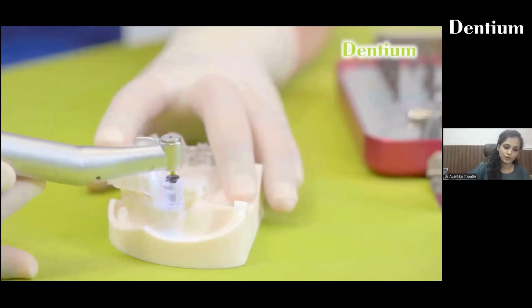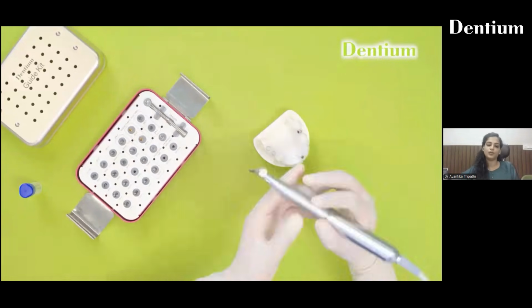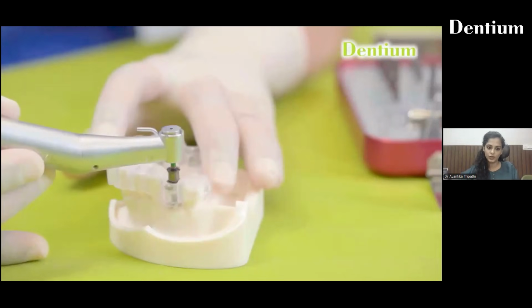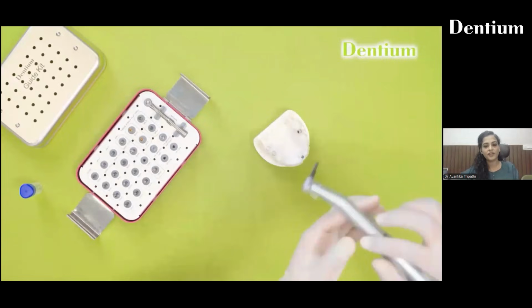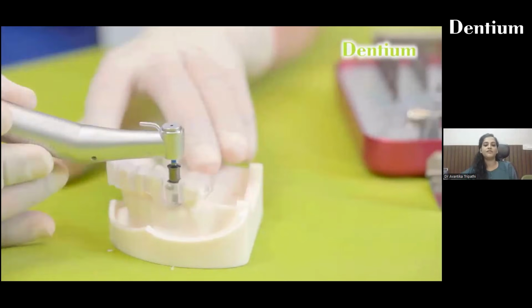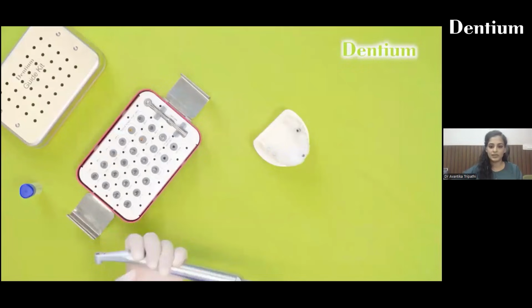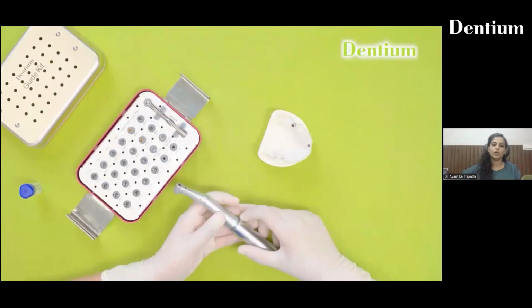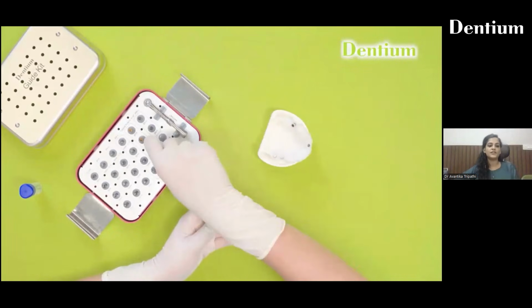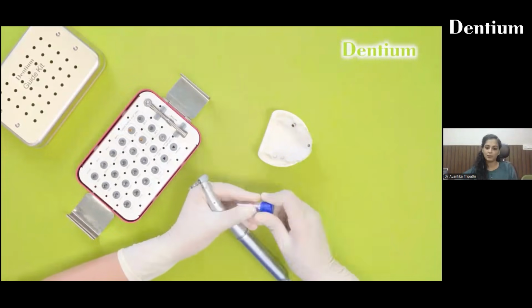Then we are going to introduce the 3.6. Then we are going to introduce the 4 mm drill. So it is a very, very precise and very, very fast way of placing an implant. Then we are going to use the same diameter drill, 4.5 mm drill of 6 mm length, as a countersink drill, and then we are going to place the implant.